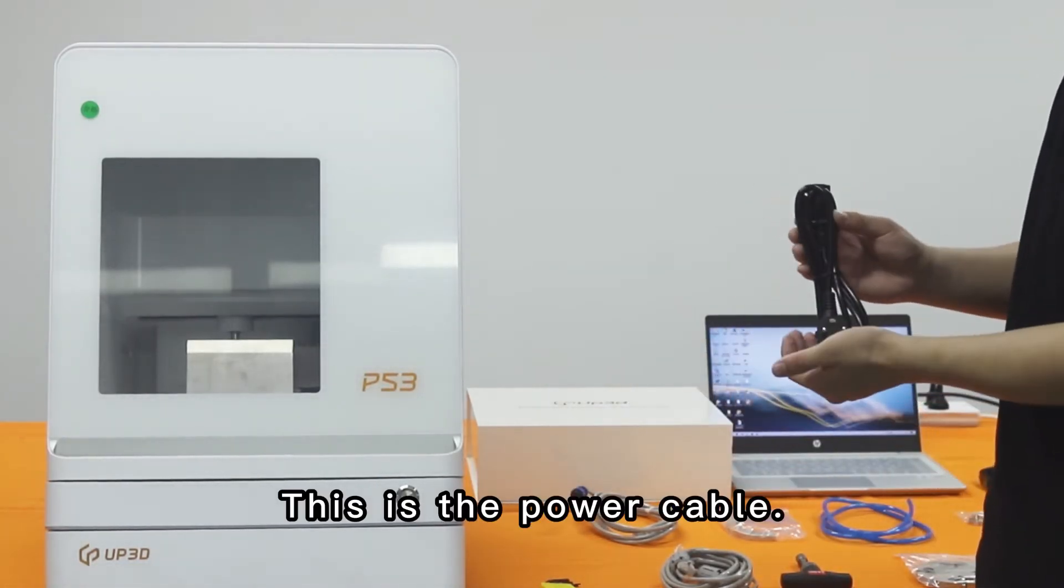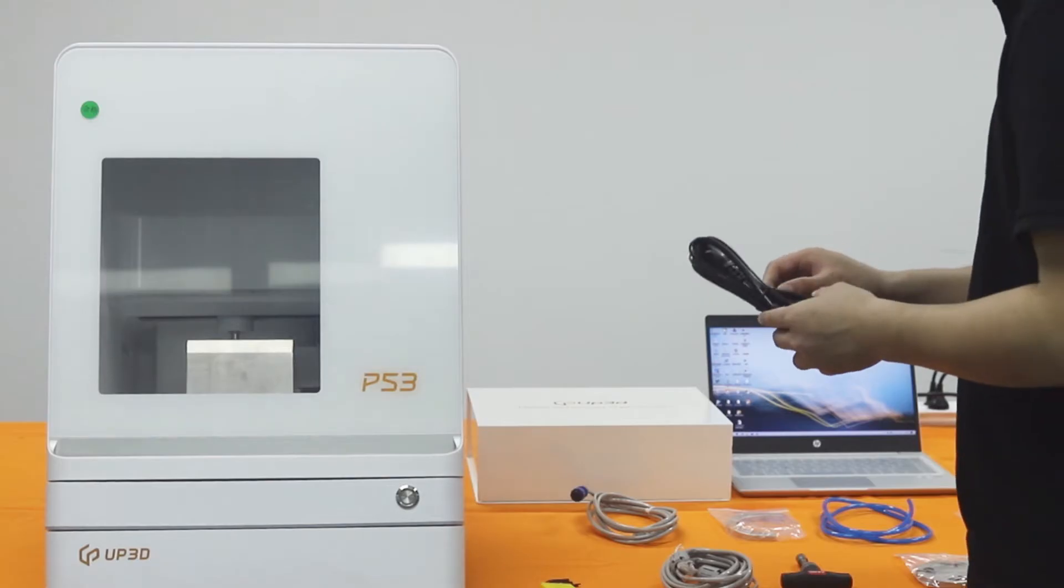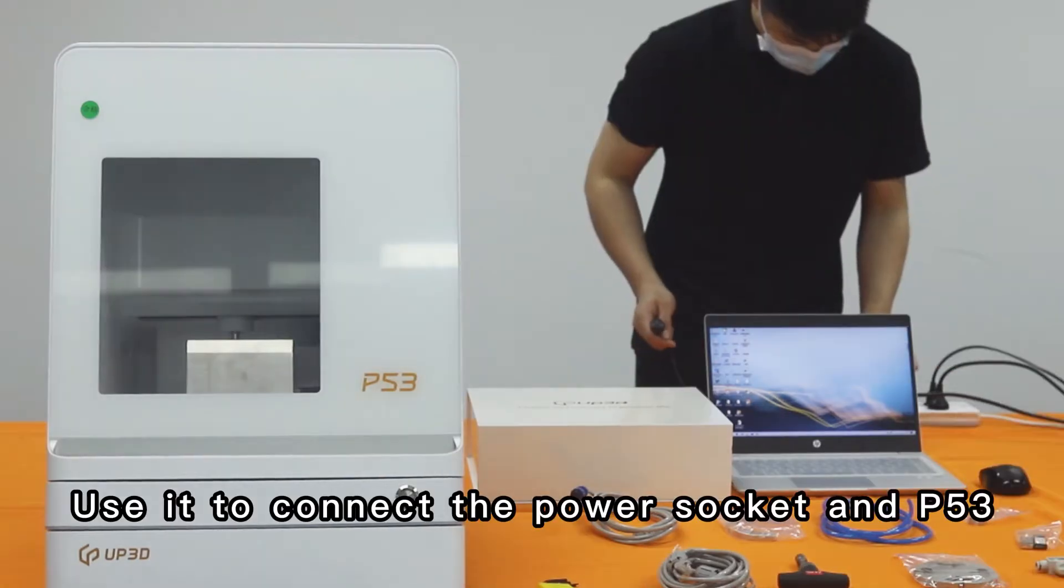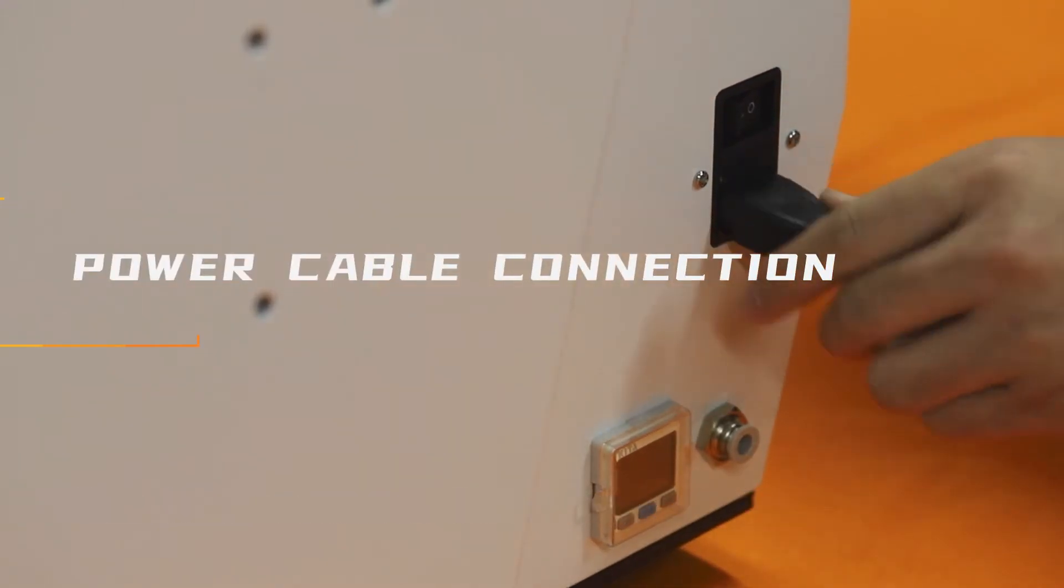This is the power cable. Use it to connect the power circuit and the P53.